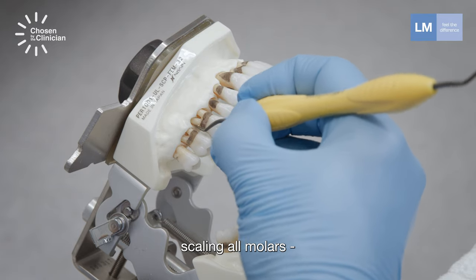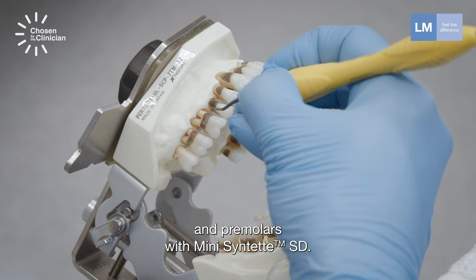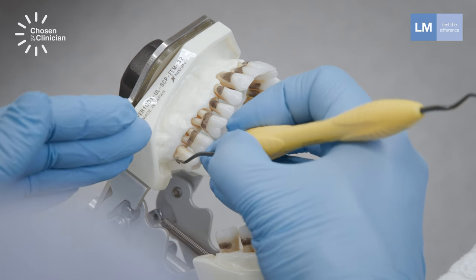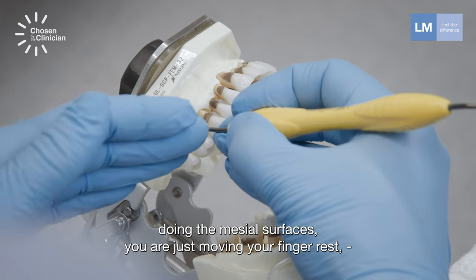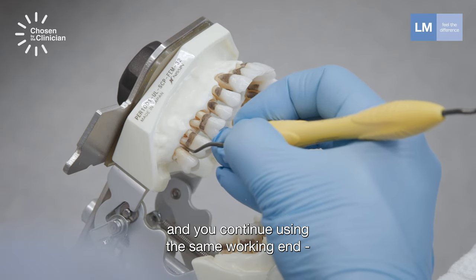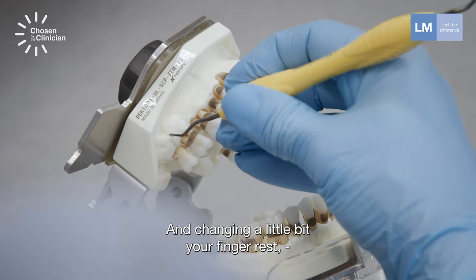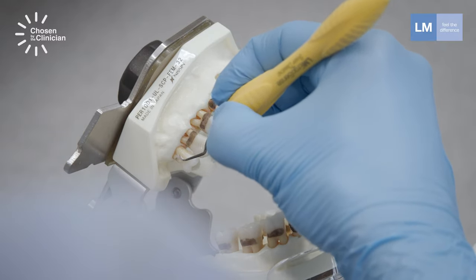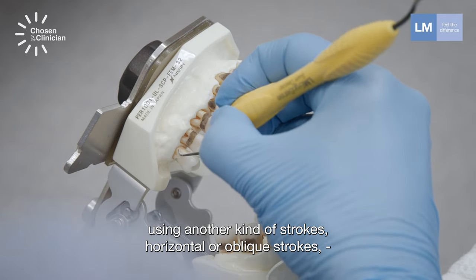Scaling all molars and premolars with Mini Syntette. Notice that you don't need to flip the instrument when doing the mesial surfaces. You are just moving your finger and wrist, continuing to use the same working end just for mesial surfaces and changing a little bit your finger rest, using another kind of strokes — horizontal or oblique strokes.